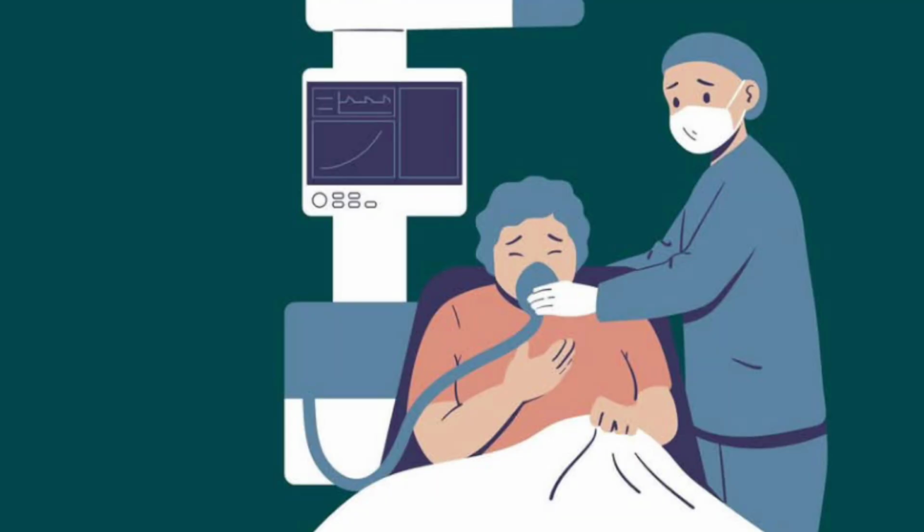Third one is to provide nourishment to the patient who can't be fed through the mouth. For example, surgery in the oral cavity, unconscious patient, coma patient. If any surgery happened in the oral cavity, in the mouth, or our patient is unconscious or in a coma stage, we can't give the feed properly to the patient. At that time we insert the Ryle's tube and provide the feeding.